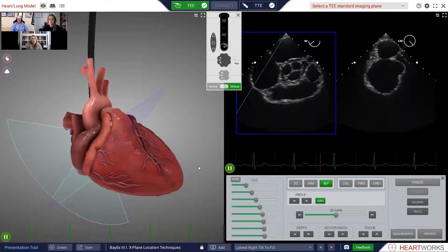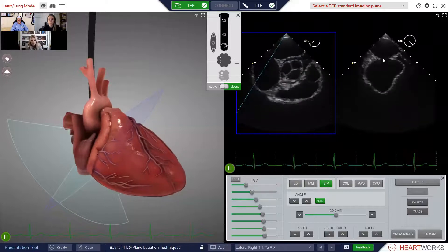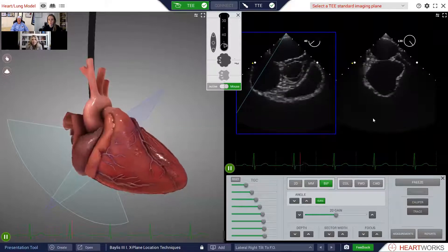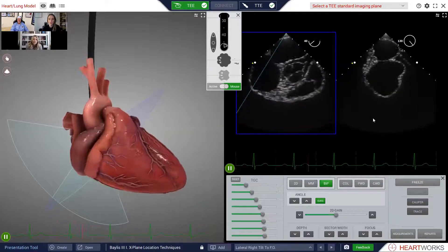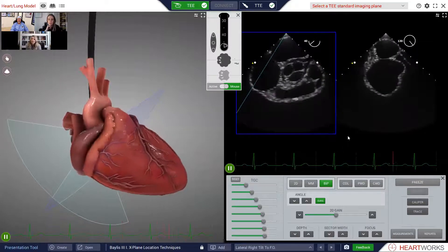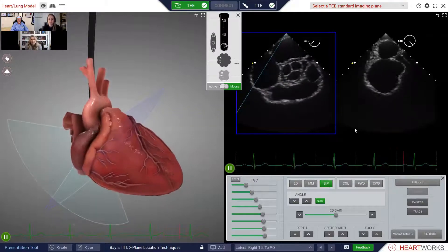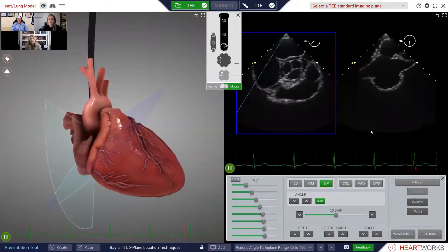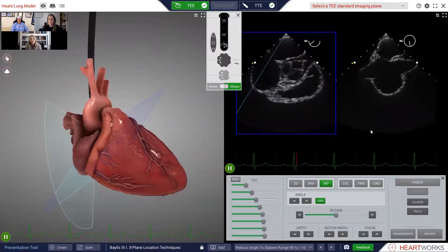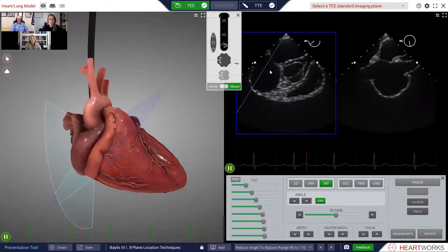So Jodi, this secondary view is showing the fossa, but in order to get it to be a bicaval view, what would you have to do to it? You have to decrease the angle of the secondary plane — that's right. That's what I did; let me do it again for you. It's this number here — watch it. So this is kind of cool because you'd be able to see tenting in both planes simultaneously.